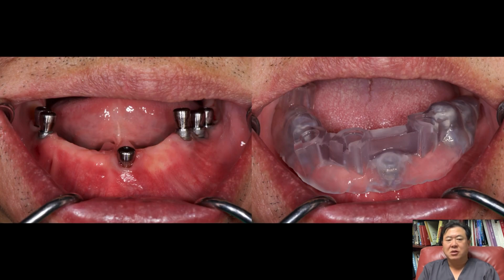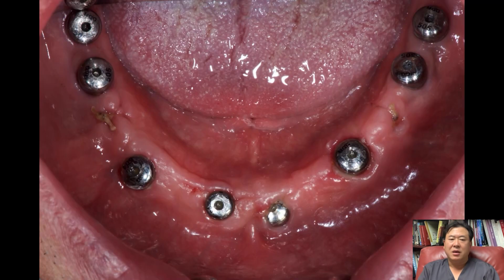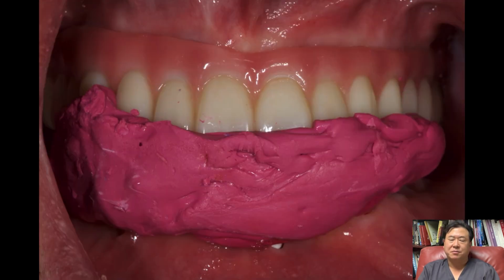Here, the surgical guide was supported by the healing abutment on the existing implants. All 8 implants were placed and existing implants were all removed. Healing abutment was placed and patient went back home and came back the next day. And this time, rather than utilizing multi-unit abutment and temporary cylinder to make a provisional bridge, I decided to directly make implant level impression over the scan body.